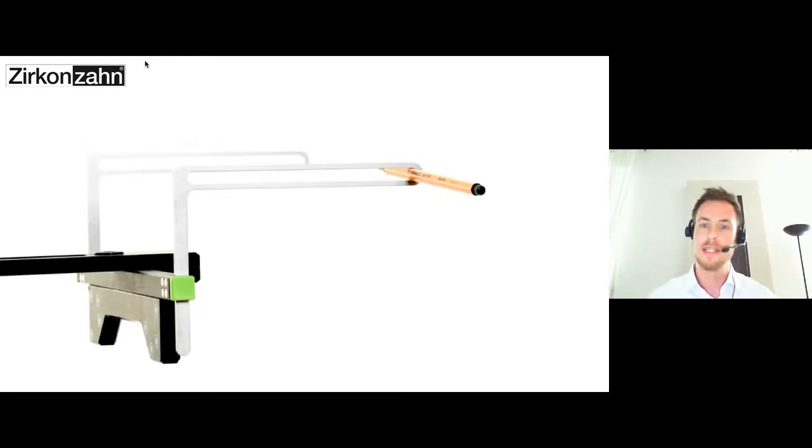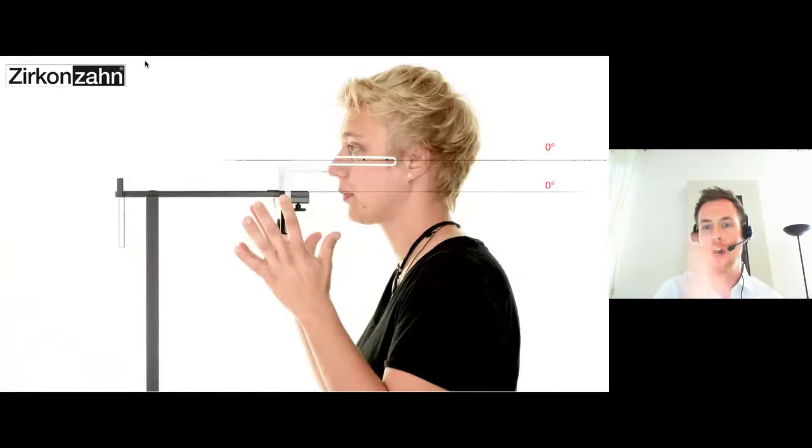The reason is we mark a straight line or two dots on the patient's face along this control angle, and the patient goes out of the plane finder, goes inside again, and then the two dots or straight line have to be on the same level as we marked before. And then we are sure that the patient can align the head at any point at any time.